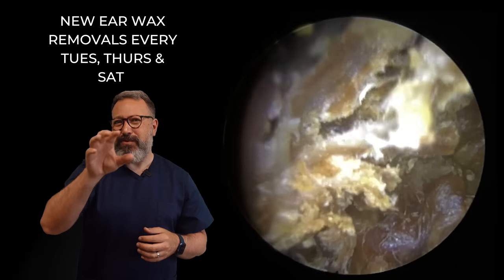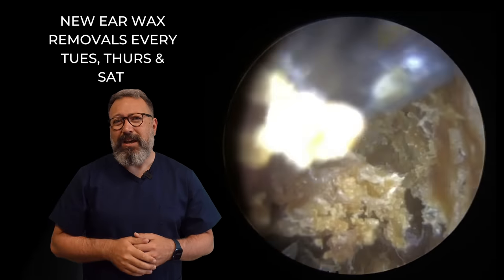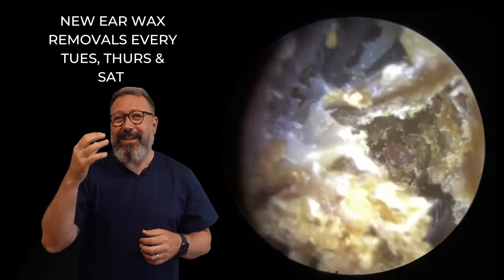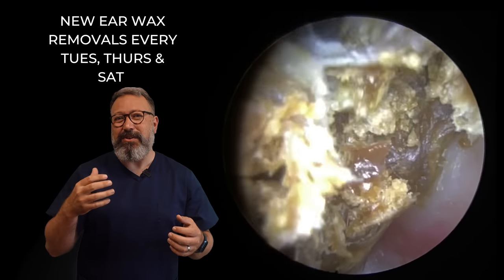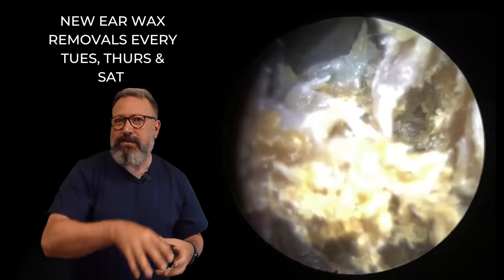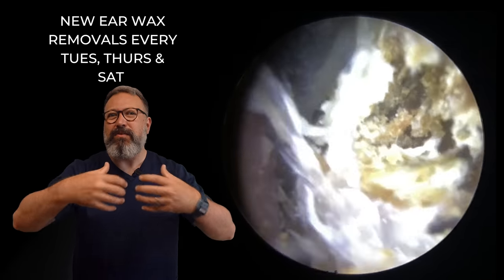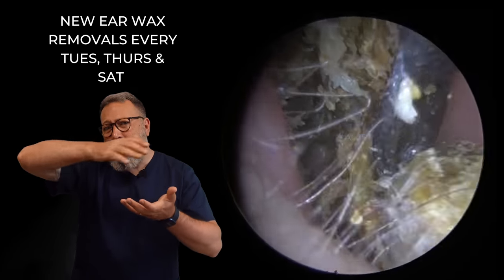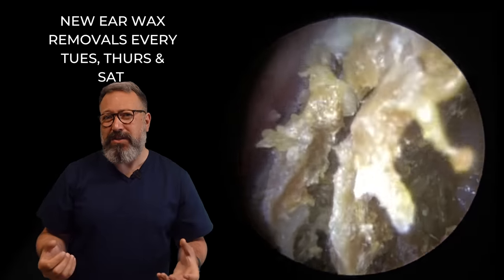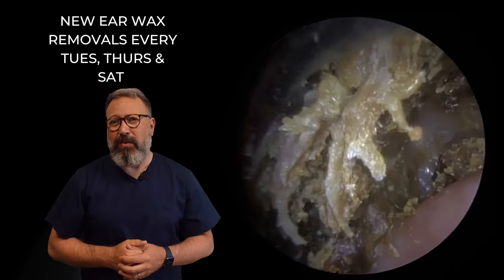With any kind of procedure like this one where the wax is tough, I'll always be checking in with the patient. The patient was feeling really well having this done — they actually liked the sensation of getting this out, which is kind of understandable when you can see the type of material that's coming away. You can see that dead skin coming away. The skin would normally migrate out of the ear canal, but when you've got these cavities that go in and out, that migration process is a lot slower on that side. Because of the scar tissue in there, sometimes that gets interrupted, so you end up with these big blockages, which is what we've got here.